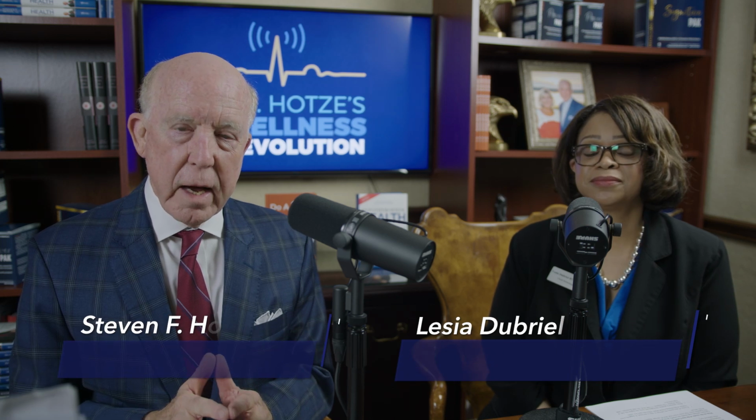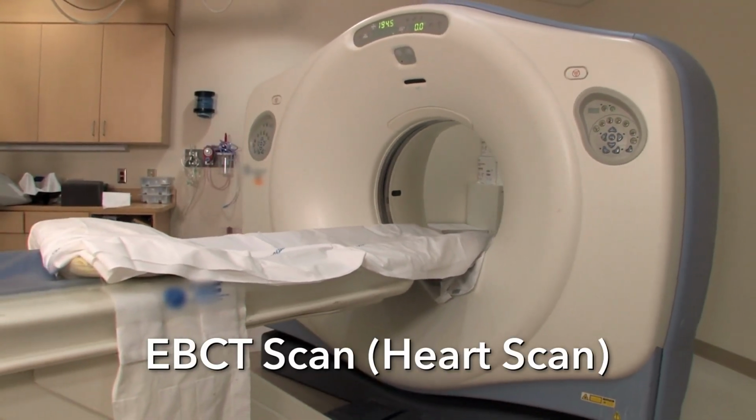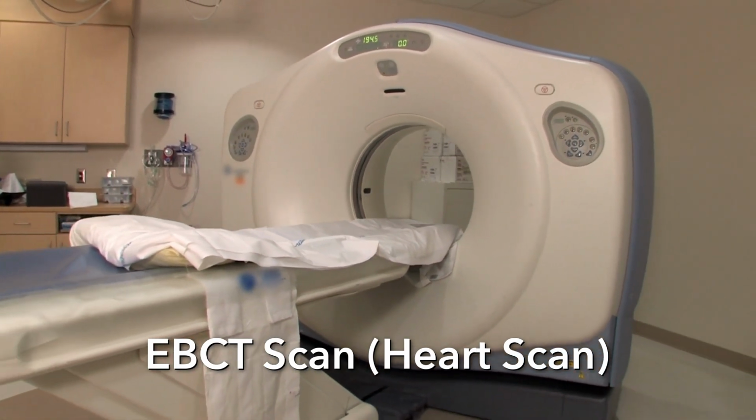Hello, I'm Dr. Steve Hotze, and welcome to the program today. I have with me one of our key staff members, Lesia Dubriel, and Lesia is our radiology technician. She runs and operates two pieces of equipment that we use for diagnostic studies here at the Hotze Health and Wellness Center, and that would be the EBCT scan, which is an electron beam computer tomography. It's a heart scan. We check your heart to see if you have any calcification of your arteries.